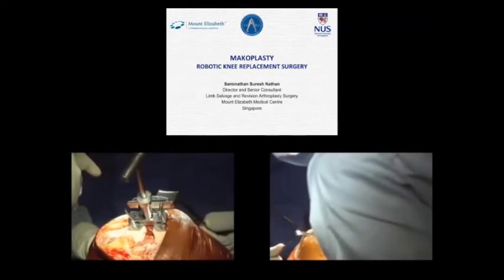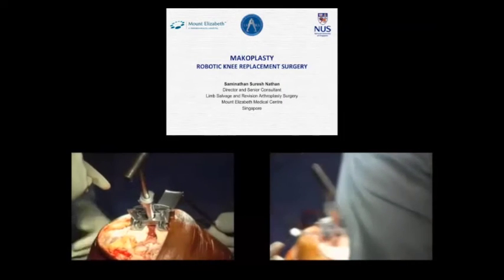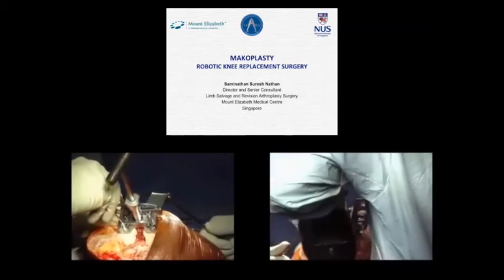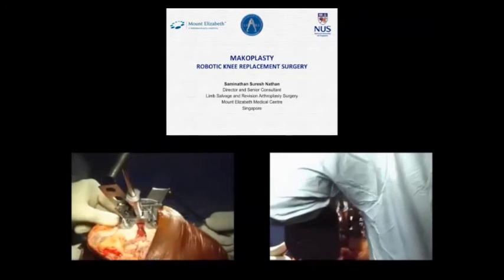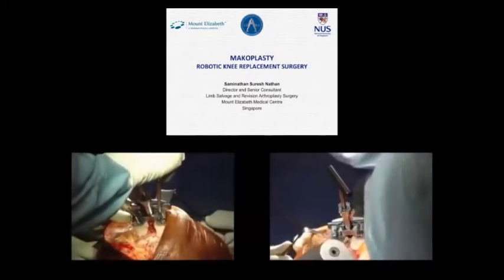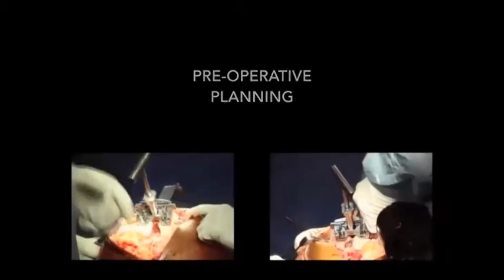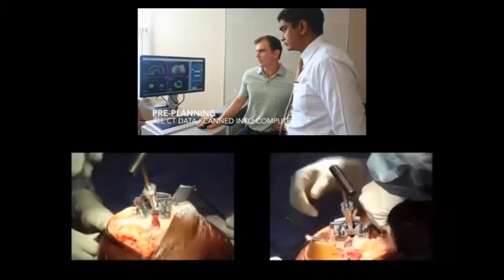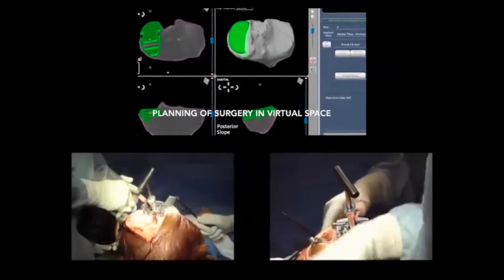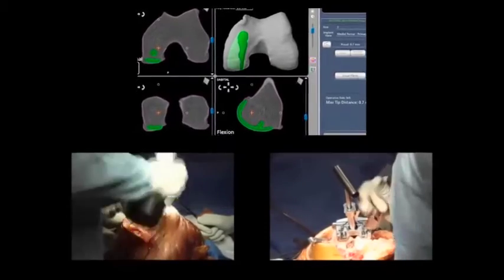The surgery in the traditional knee replacement categories — with and without tourniquet on the left and right respectively at the bottom of your screen — has begun. You can see the jigs have been put in place and we are beginning to instrument the distal femur. A lot of this is done pre-operatively; here we see the CT scan data being reviewed prior to the Makoplasty above.